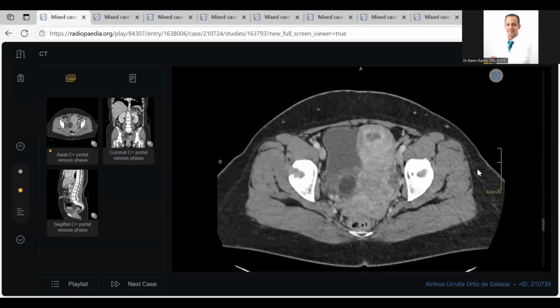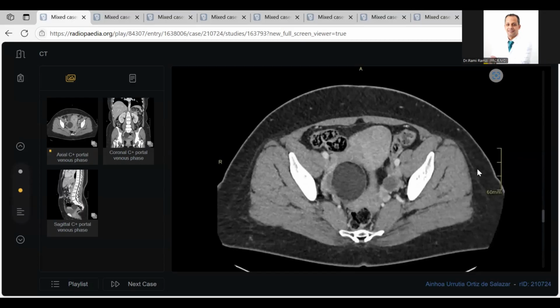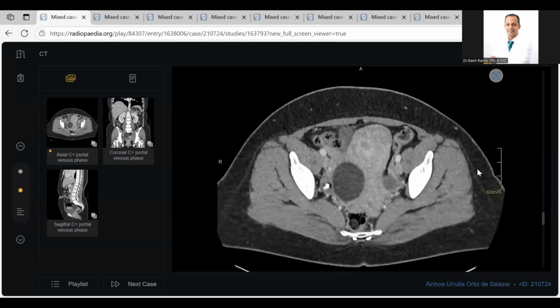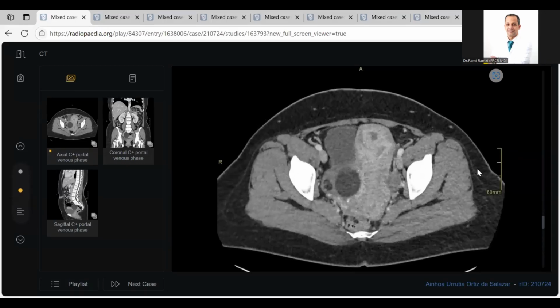Give me two signs of ovarian torsion. On CT, I would look for secondary signs mainly, like surrounding free fluid, twisting of the mesentery, surrounding fat stranding. The primary signs: the ovary would be located in the retrouterine region. There will be hypoenhancement or non-enhancement of the compressed ovarian tissue and the lesion itself.